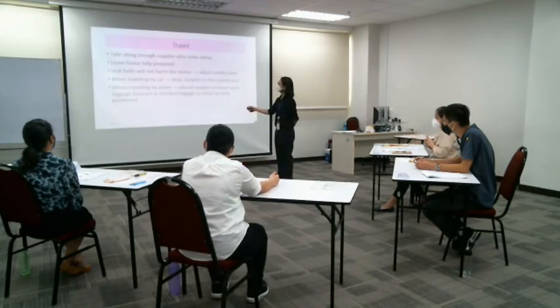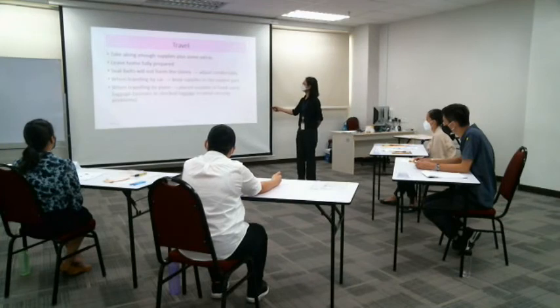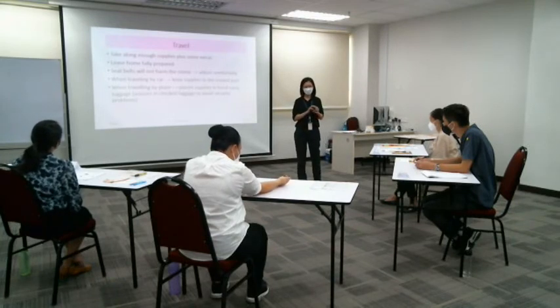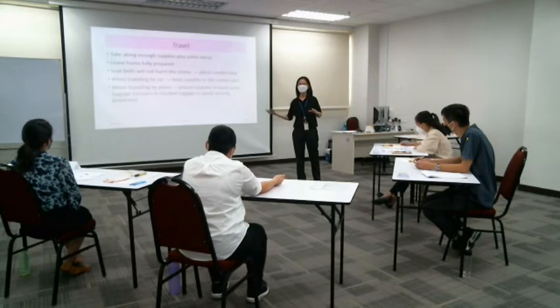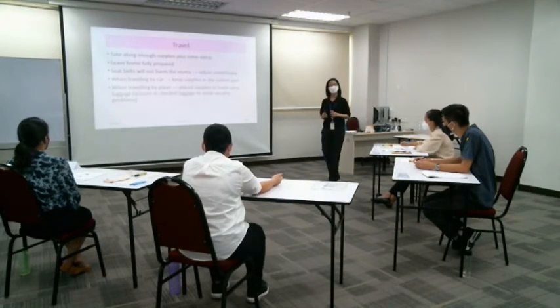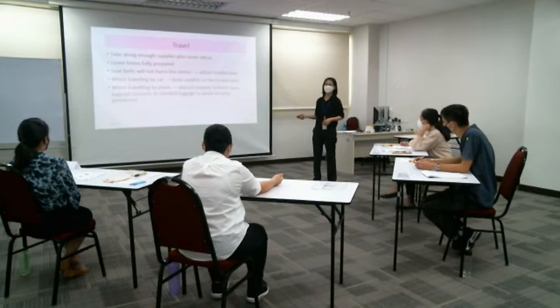So what do you advise the ostomate? Take long enough supplies plus extra. So if I want to go for 9 days, I take 9 days of supplies and then plus extra. If you can, double it; if not, then 1.5. Okay? Take extra supply with you because you are familiar with what you have. You're going to travel abroad, you're going to travel to other places.